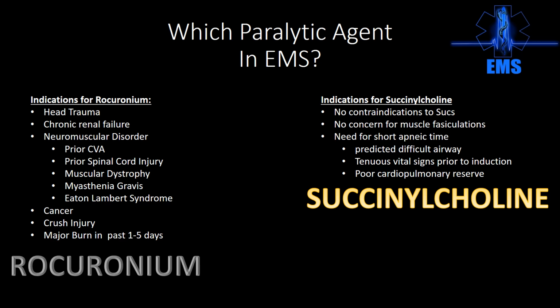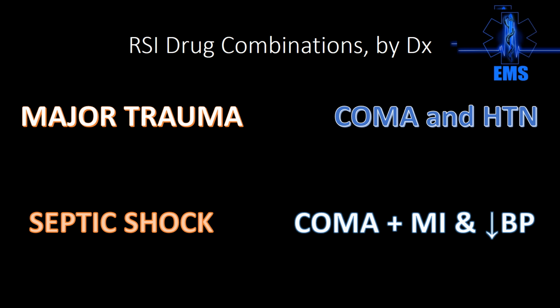And then patients who have poor cardiopulmonary reserve, i.e. patients who will not tolerate hypoxia. For the vast majority of healthy patients, if we were to pre-oxygenate you for elective surgery and we were to put oxygen on you at high pressures and use a PEEP valve, you could have an apneic period where you were not breathing of about 8 minutes before you desaturated below 90. Some of our patients have an apneic period of 30 to 60 seconds. That means one look. This is why this is so important.